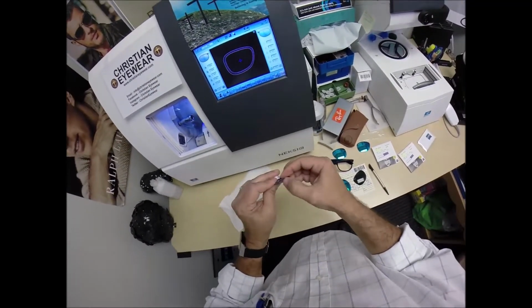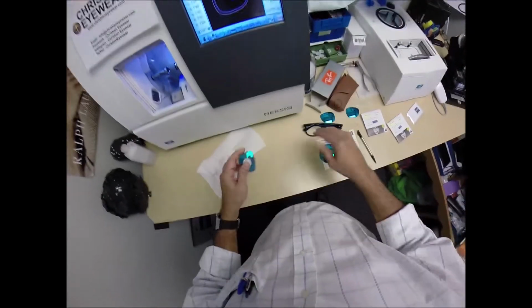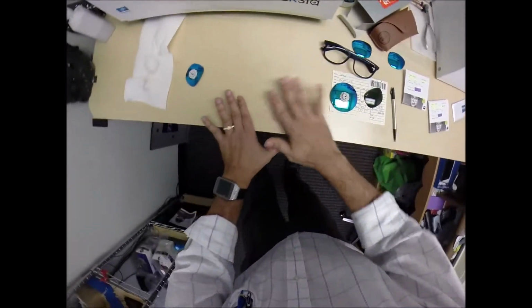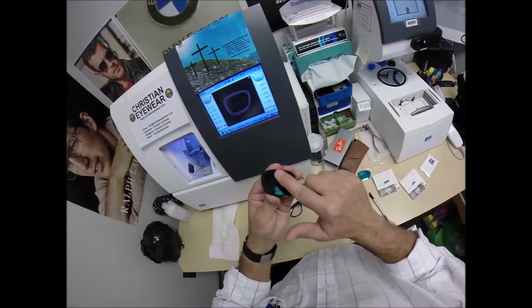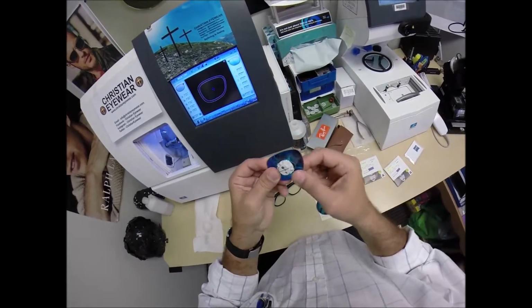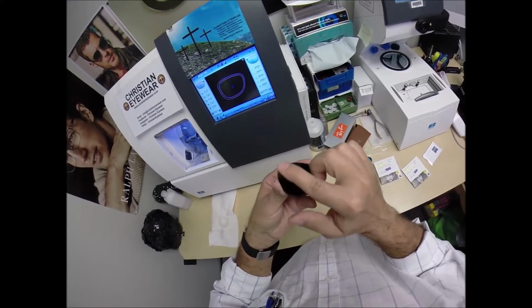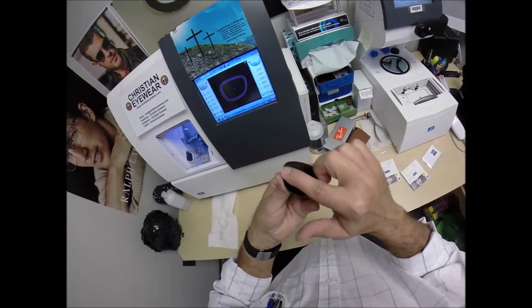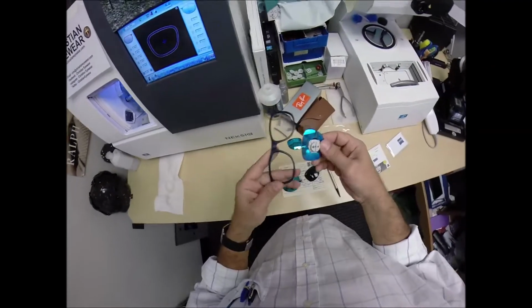I'm gonna scrape all of that off. Once it is all the way off the lens, I collect it neatly into one pile on the counter, and then I wipe it on the floor. So let's see, I put a safety bevel on the back surface of the lens. It's not like the front of the lens is sharp by any means, but I want to smooth this out as much as possible. Especially, I do the entire lens because I only want this to be smooth, because I'm going to see if this fits first time around.